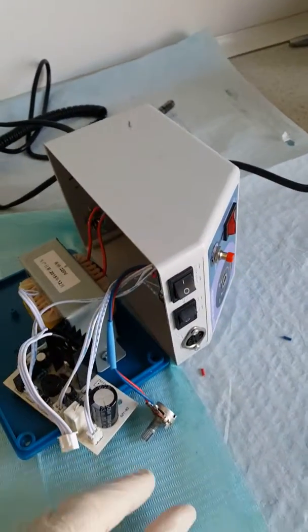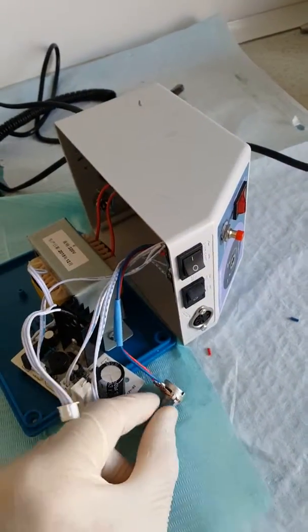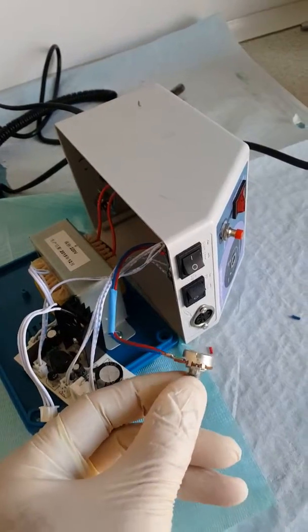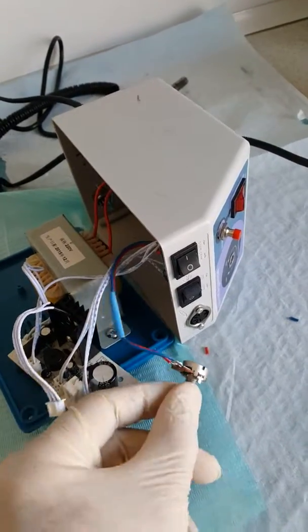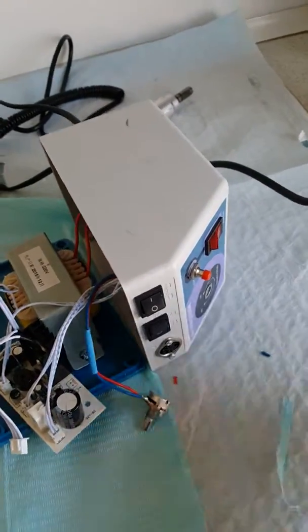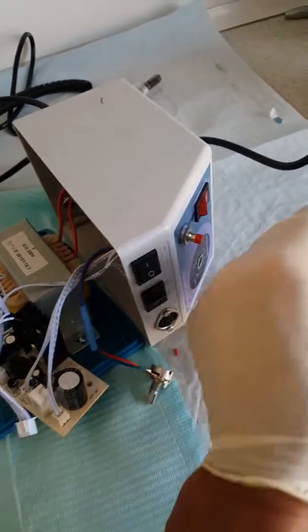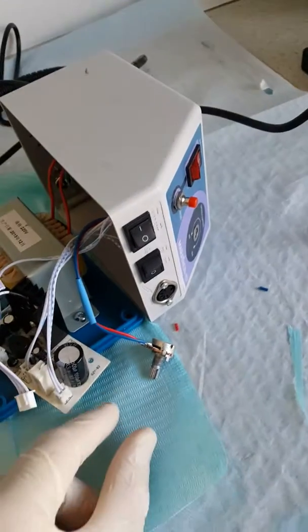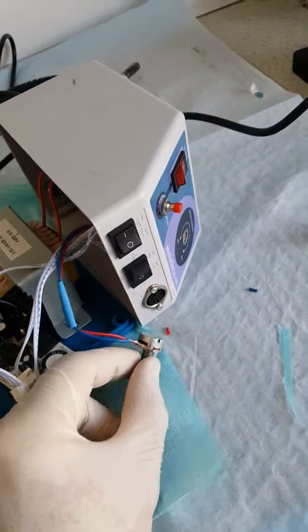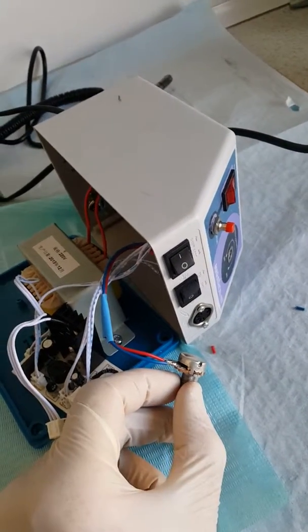So I thought the potentiometer would be broken. I got a new one, replaced it, but still it would spin at maximum speed.